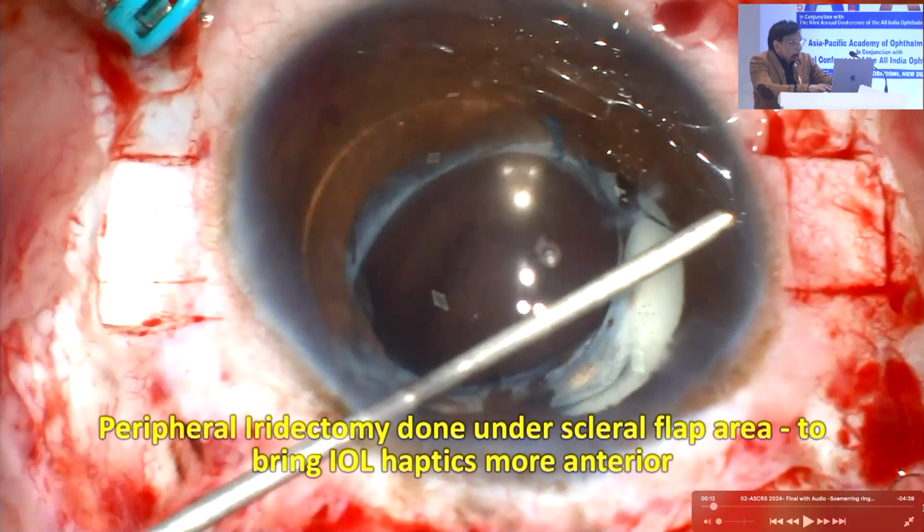Yeah, so I mean, this would be a great case to just suture the haptics to the iris as one option, but when you have the Soemmering ring that's that big, that'll get in the way. So you do have to try to strip it off, and you know, Sun Pek Chi has a beautiful technique where she uses an empty IOL cartridge, and if you pressurize the globe with viscoelastic, everything wants to exit through that exit pipe, and that might be useful in this type of case. But that can happen only if you have a support behind.